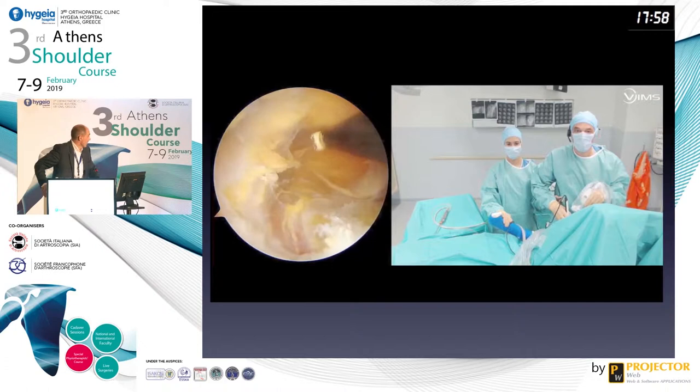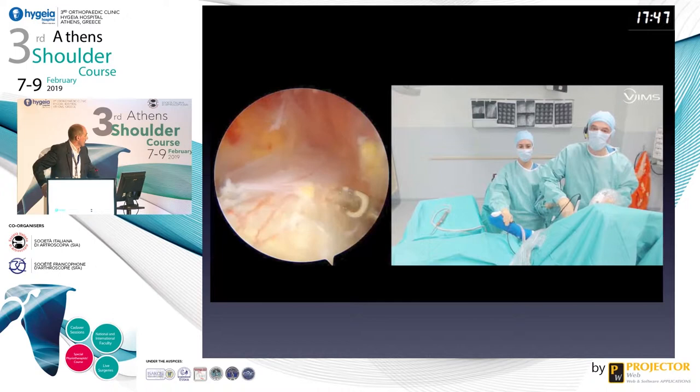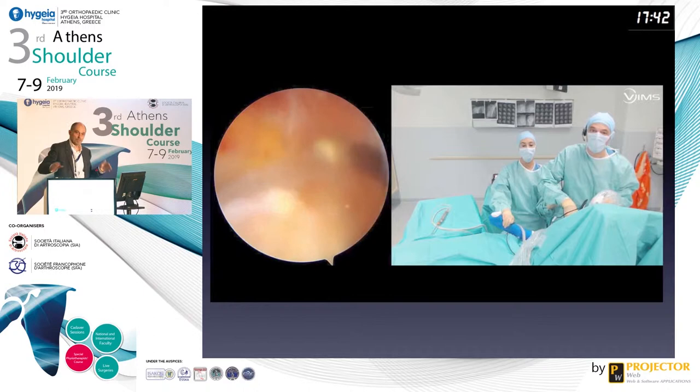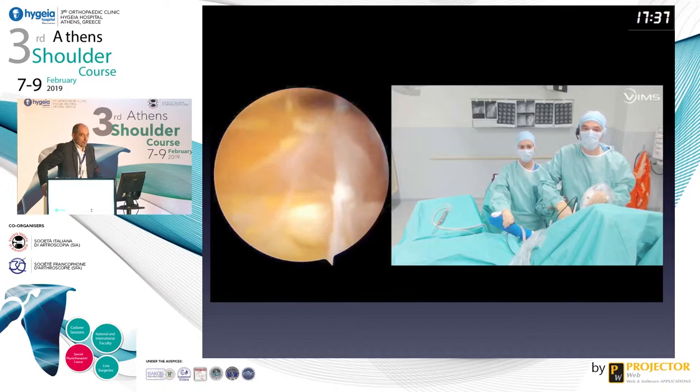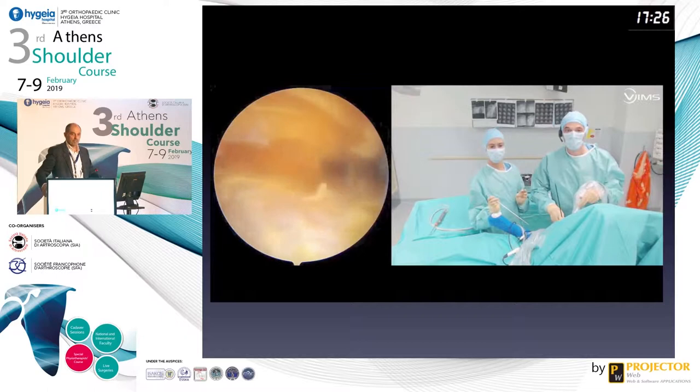So please take care. And we are going to see very quickly now the junction between the lat dorsi and the teres major. So you continue. We are here at the distal part, and on this is the shaft of the humerus. You are at the distal part of the tendon. And step by step, you try to isolate the two edges of the lat dorsi. And this is the radial nerve, the yellow. You try to make a very smooth and gentle dissection because this radial nerve, in fact, gives some divisions to the long head of the triceps.